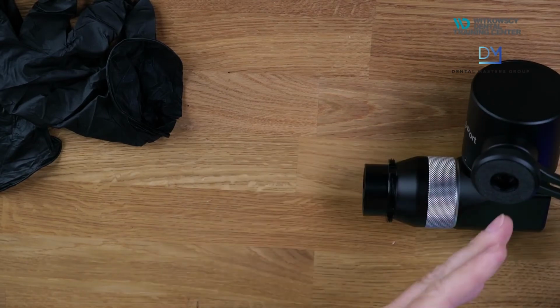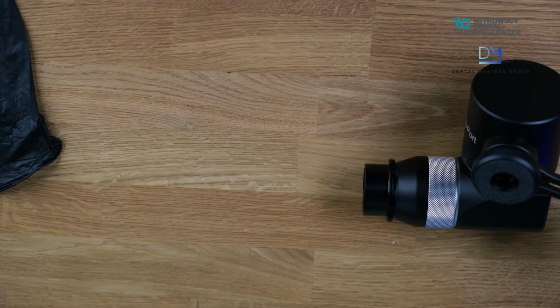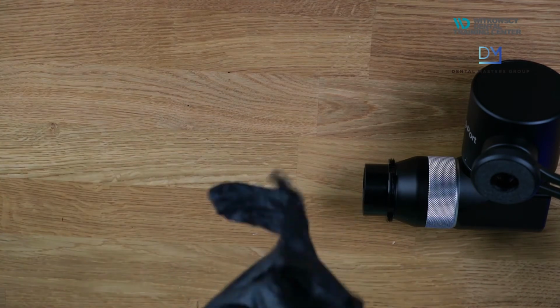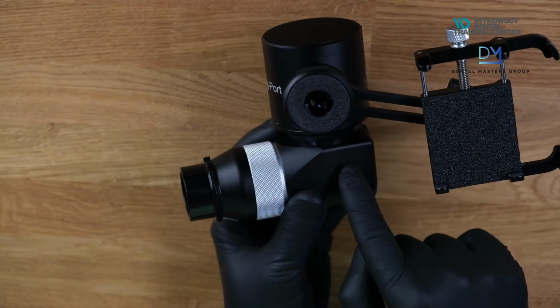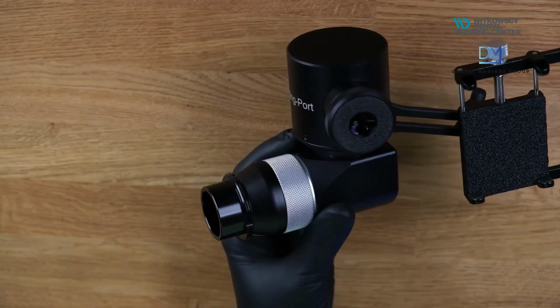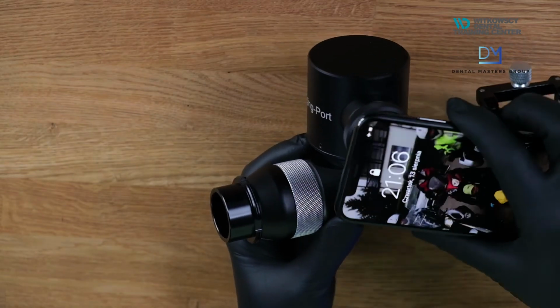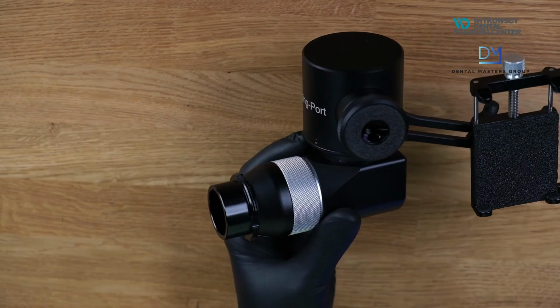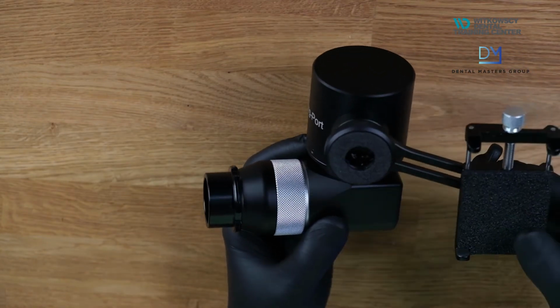Okay, so let's take a look at this. I will just put on some gloves so you can have a better view. We will feel like doctors now. So, how is it built? Here you put the lens of your telephone. You position your telephone here to see through the telephone, through this adapter.